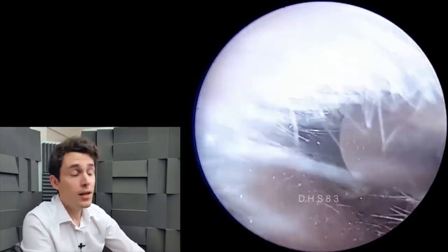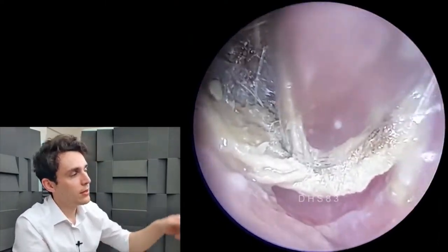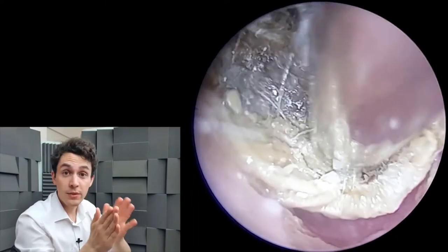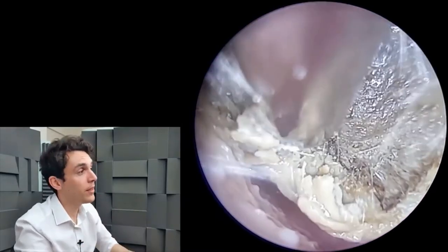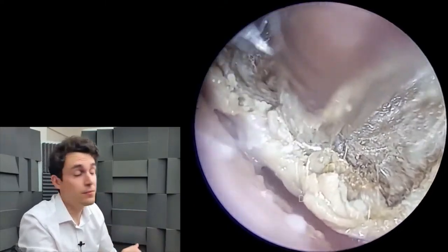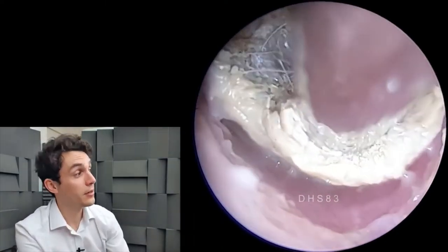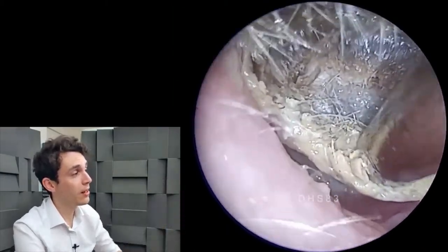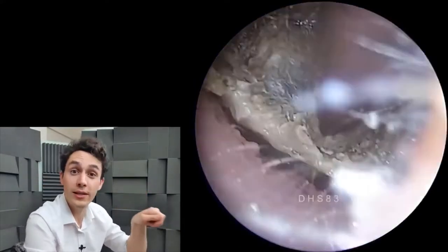One of the things I teach students, and that most people know when doing microsuction, is that if somebody has had a healed perforation within the last few months, suction can be incredibly dangerous. When you have a plug like this and you're pulling on it, because there's a tiny air pocket between the eardrum and the plug, pulling on that plug creates a little pull on the eardrum. If you have a perforation which is just about healed, you could pull on that area of weakness and reopen the perforation. This person hadn't mentioned anything like that and has never had a perforation, but the principle of opening up the canal first and creating gaps where air can flow through is probably a lot safer and more comfortable for the patient before you use the Clearway.